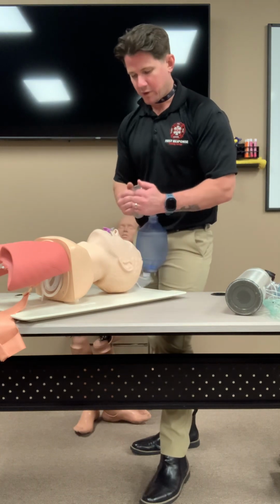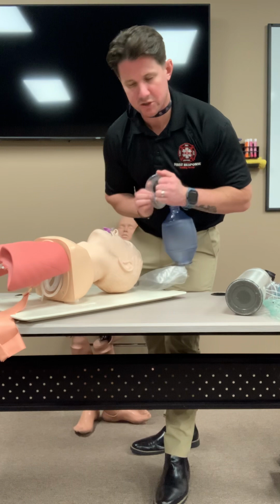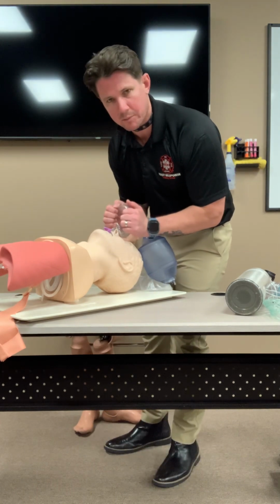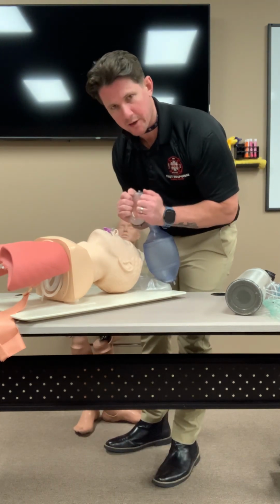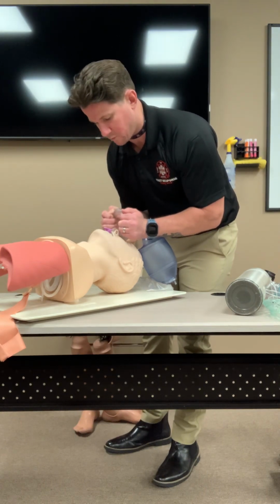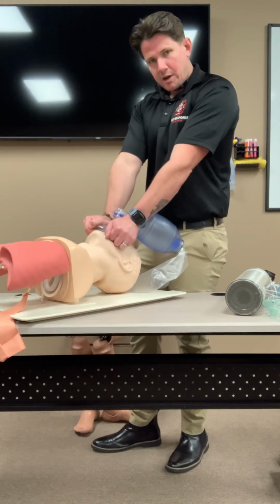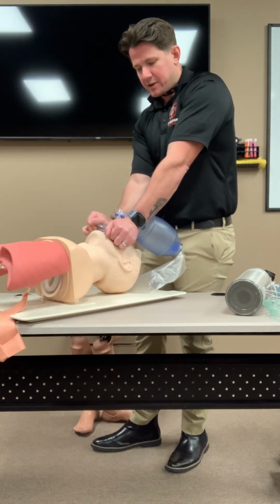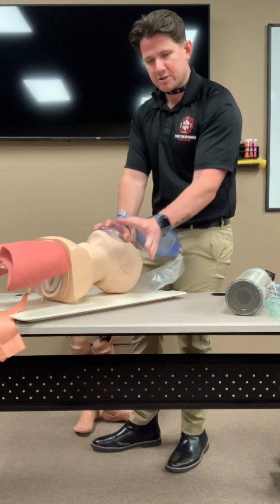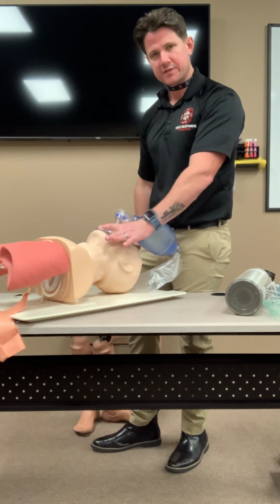So that's important here, because if I do that, I want to put the tip of my mask at the level of the pupils on the bridge of the nose. I want to pull this apart, okay? I'm going to put it at the line of the pupils, and I'm going to roll this down the patient's face. When I get it covering the patient's face, I'm just going to slip my fingers out, and what's going to happen is this mask is going to try to come back to its normal size, and it's going to almost create a suction on the patient's face.